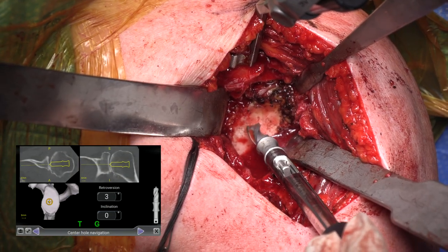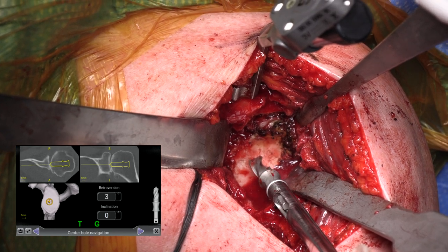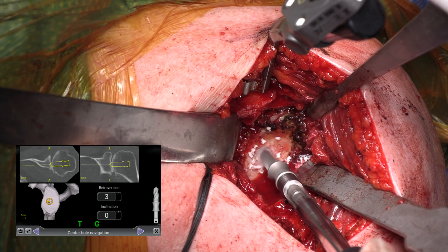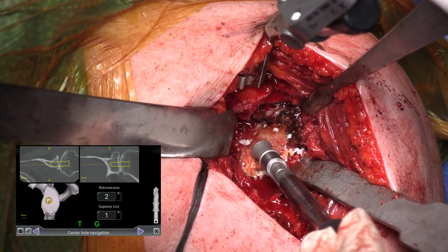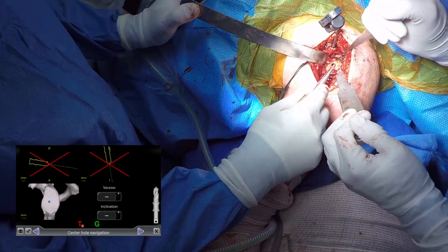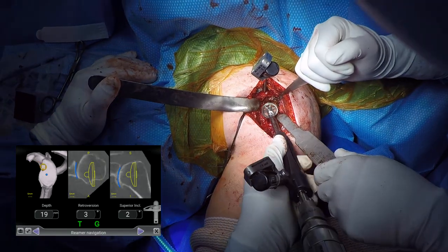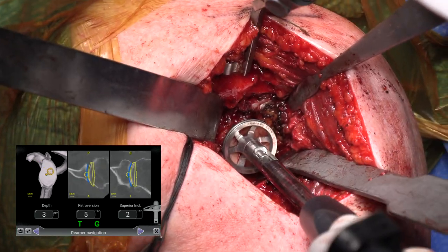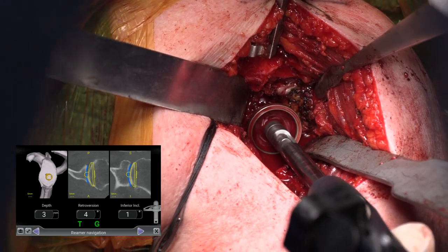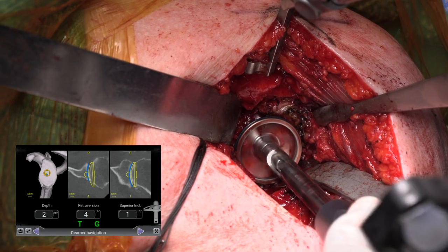At this time, the first drill bit is used. The navigation is used to identify the starting point based upon preoperative planning, and the drill hole is made to the appropriate depth and angle. Reaming is then performed using GPS navigation to maintain the proper amount of version and inclination. In this case, reaming was done at three degrees of retroversion as planned preoperatively.